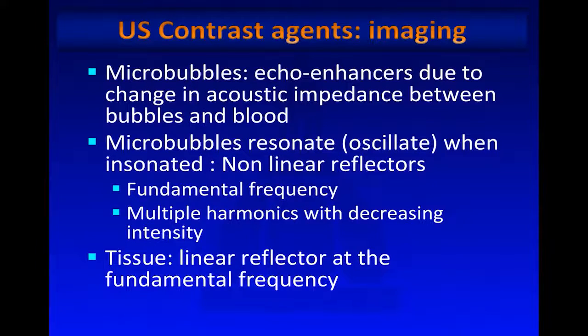The way it works is that these microbubbles are echo enhancers, because of the change in acoustic impedance between bubbles and blood. When they're insonated, they resonate. They resonate at the fundamental frequency and at multiple harmonics of the fundamental frequency, with decreasing intensity. So they're basically non-linear reflectors. By contrast, tissues are linear reflectors at the fundamental frequency.